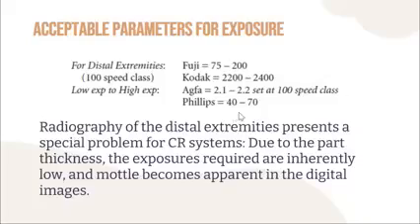Then for Philips, it's 40 to 70. So what is its median pixel value? It is 55. Okay, so the median pixel value for Philips, whose range is 40 to 70, is 55. Okay, so there is an increment of 15. So 55 plus 15 is 70. 55 minus 15 is 40. So that is the scale.